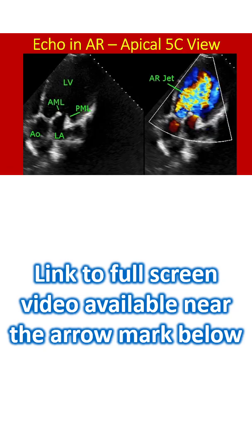An apical 5-chamber view shows the dilated left ventricle, thickened anterior mitral leaflet and posterior mitral leaflet. In this view also, the AR jet is large, extending deep into the left ventricle, indicating severe AR.